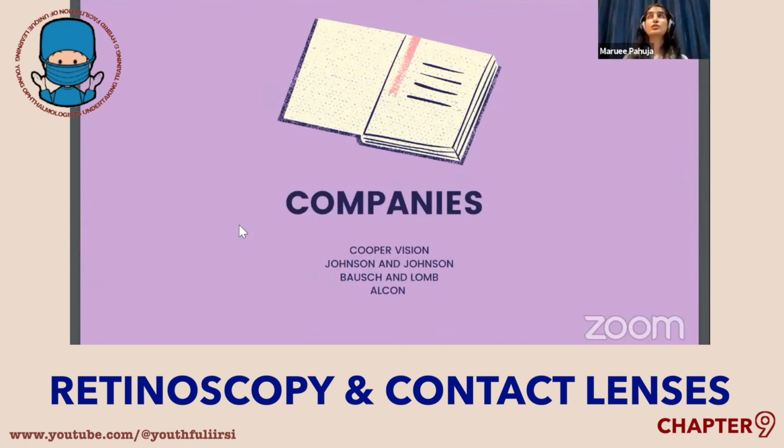A lot of the lenses that are easily available in the market go up to minus 2.75 diopter cylinder and minus 20 diopter spherical. They're available first in 0.25 steps up to minus 6, and beyond that, in 0.5 diopters.